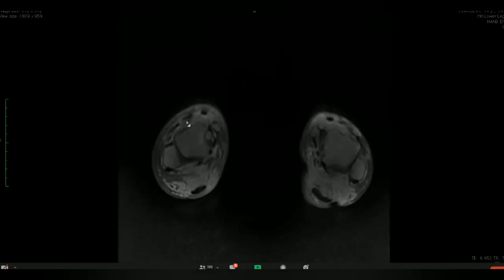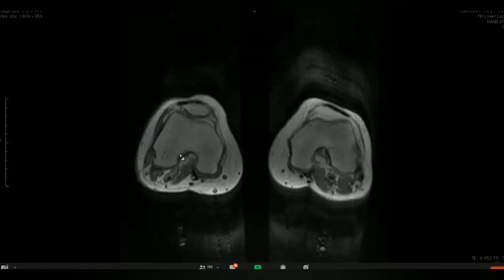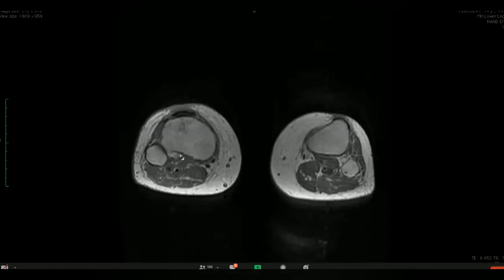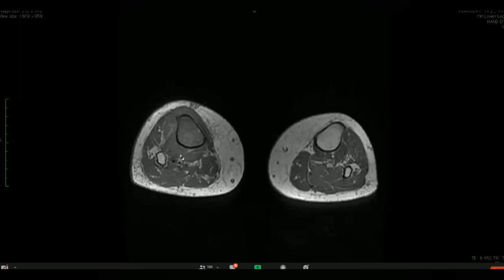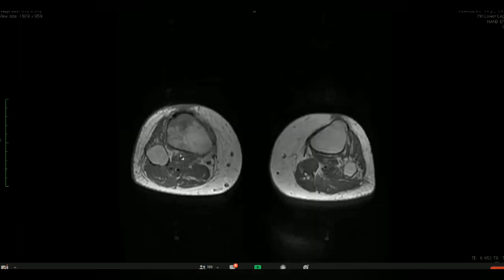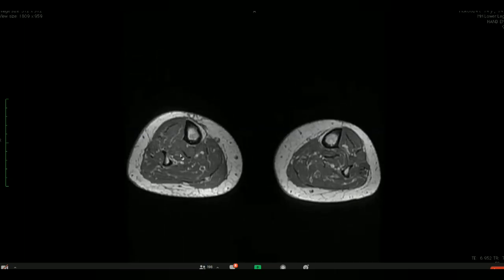The first thing you're going to do is basically confirm. When we are reporting as radiologists, we don't have the clinician standing with us. We don't have the patient standing with us, so we can't really ask questions. So what we tend to do is look into the history and ask, what's the history? If there's a history of lymphoproliferative disorder, we usually then give the appropriate differential.